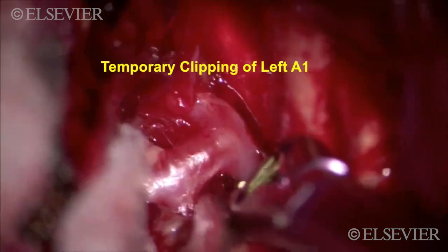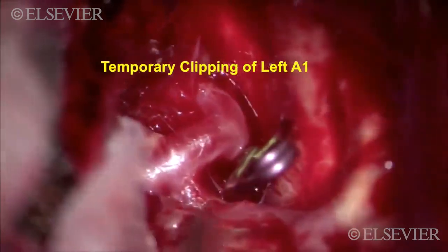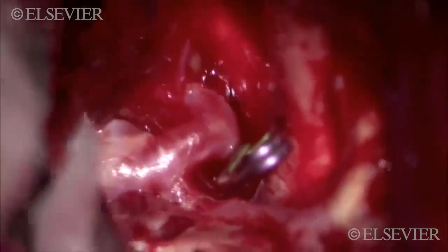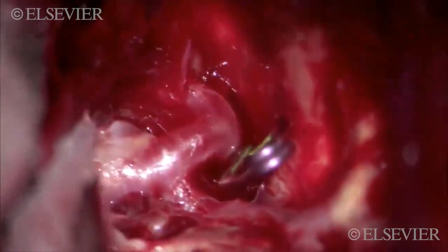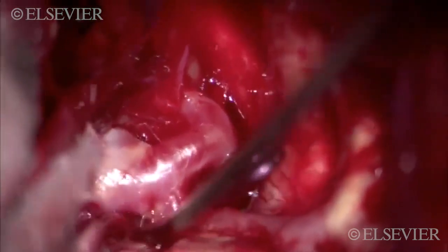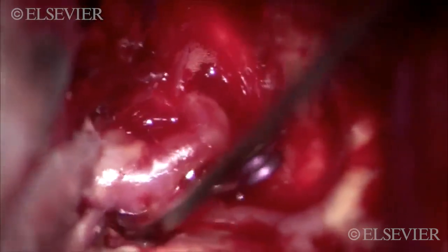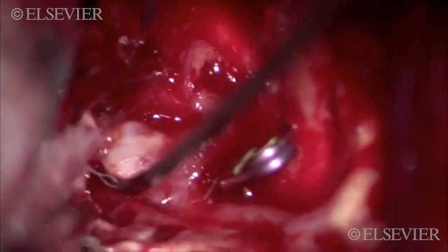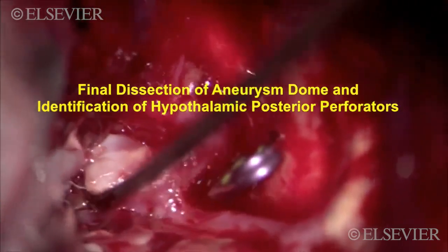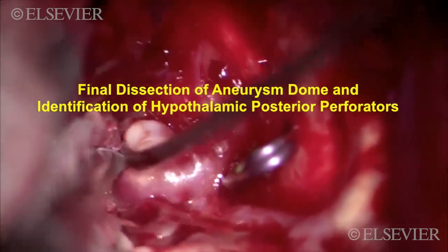We start by a temporary clipping of the opposite left A1 segment so that the temporary clip is out of the way. At that point, I proceed with dissection of the aneurysm neck. What's interesting in this view is that the right A2 segment is hidden because of the rotation of the complex and is actually embedded right at the interhemispheric fissure.